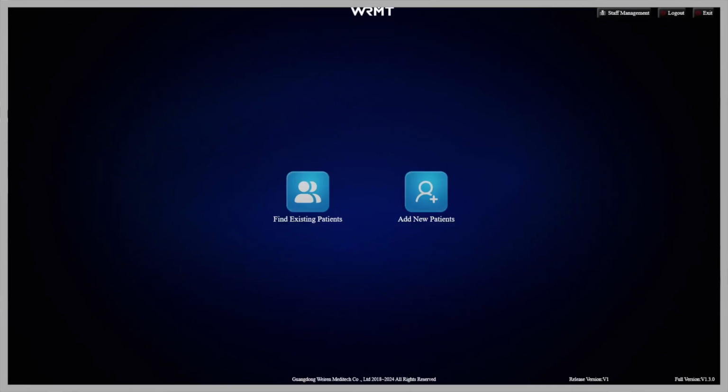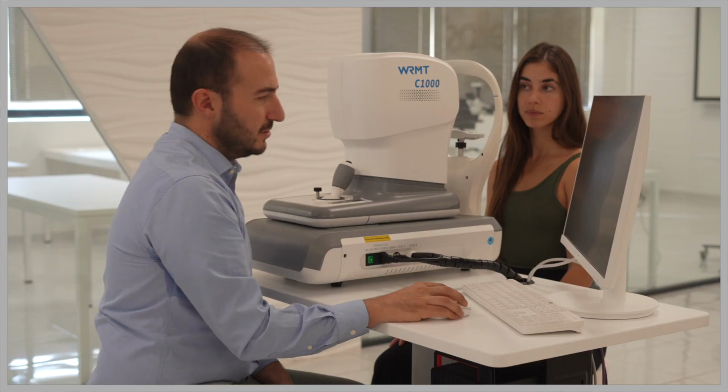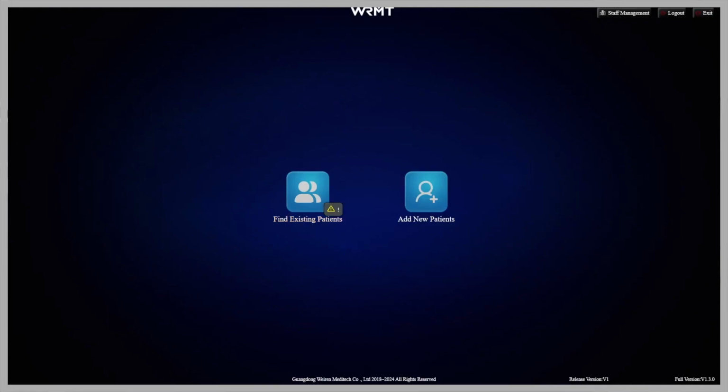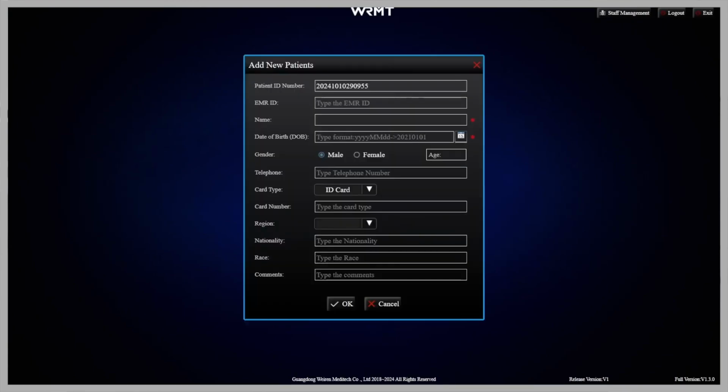Are you ready, Faye? When we start the software, we have the option to find an existing patient which already has examinations in the database, or add a new patient to start a new examination from the beginning. So we add a new patient.